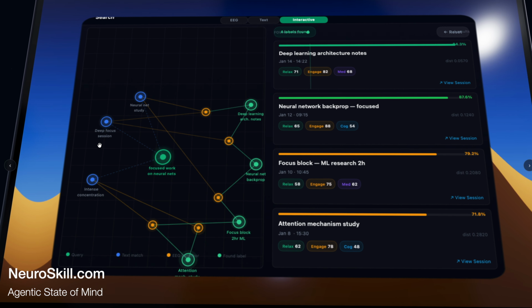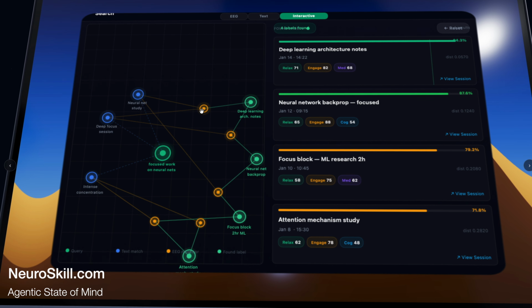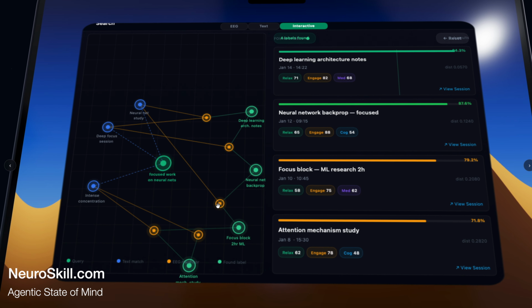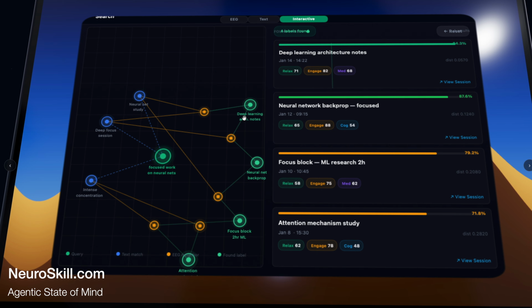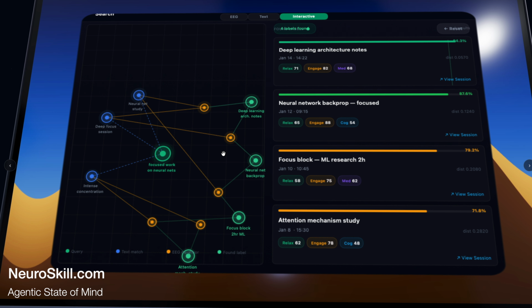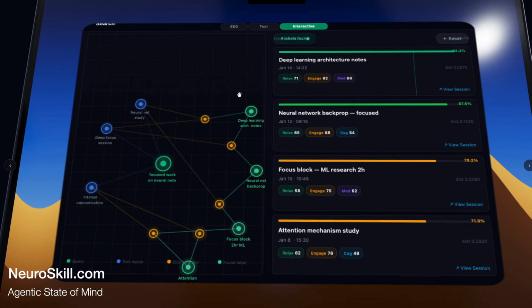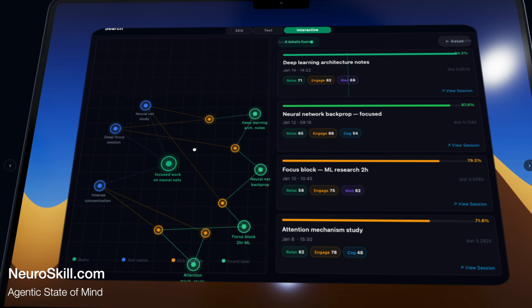This will be those labels here in blue. The search will actually pull you the EEG labels here in yellow. And more importantly, it will pull up the similar labels here in green that correspond to those EEG labels closely. And you can, of course, play with them and see what is actually happening.